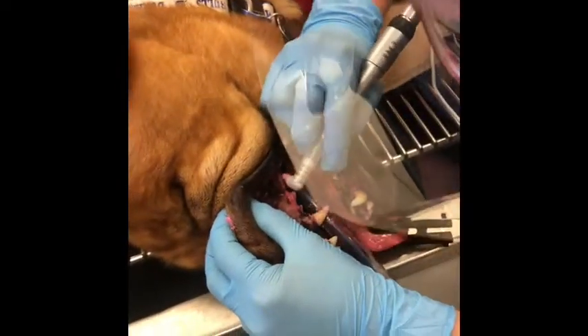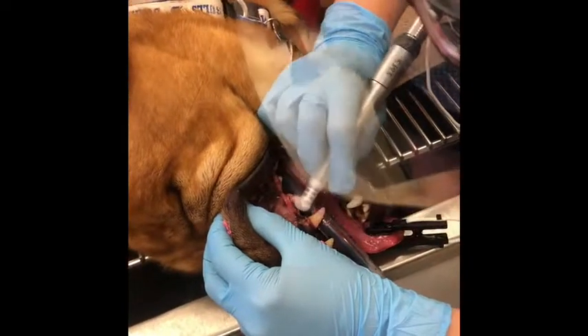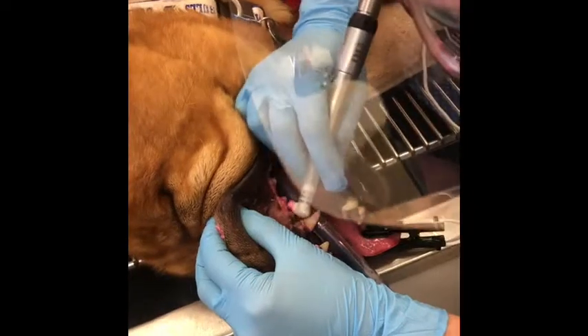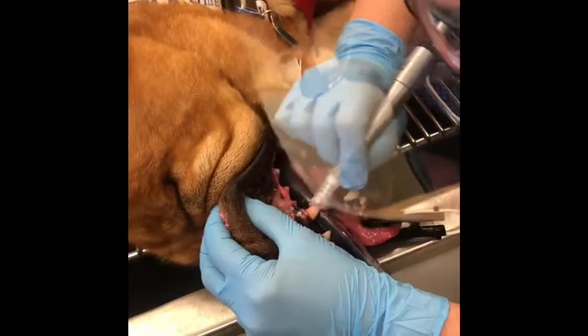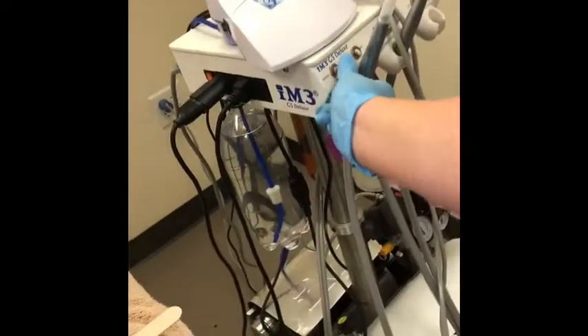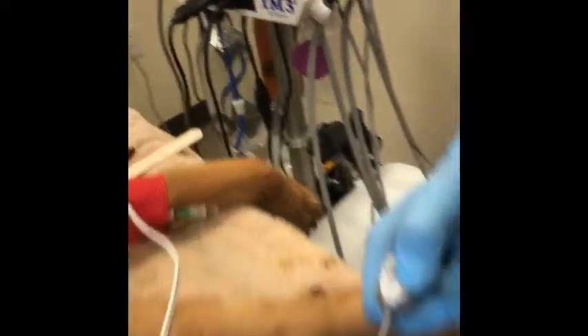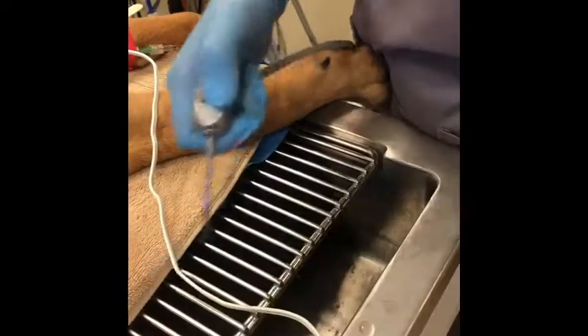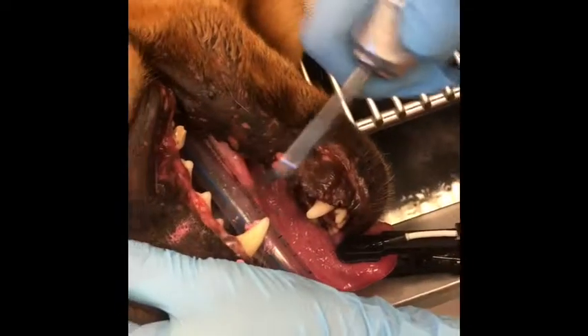What we're going to do is get the inside of these teeth whenever we flip them. We're going to do our chlorhexidine rinse. We're lucky enough that this machine has it connected to the machine, so once it goes through the tubes, we'll just do a gentle spray.